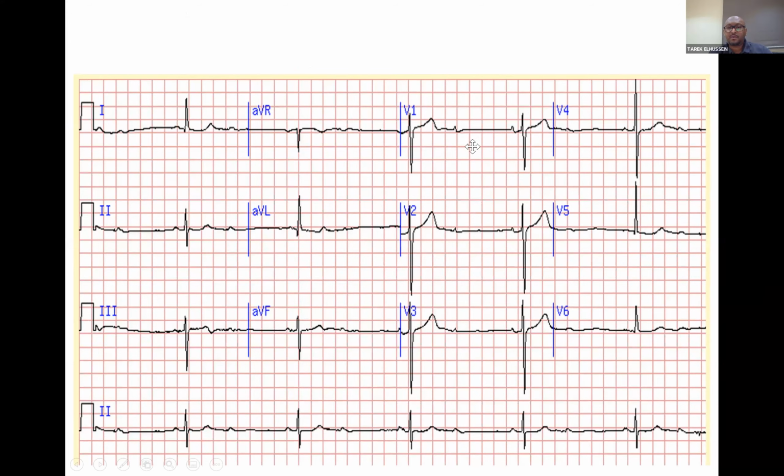And there is another P wave here. You see here that there is a baseline artifact, but down the road there are 2 P waves. So this is a P wave, this is a P wave, and this is a P wave. If you follow the PP interval, you will find it fixed all through. So you have an organized atrial activity. So that's a sinus rhythm, it's not an atrial tachycardia. So that's a sinus rhythm, and there is 2 to 1 AV block.